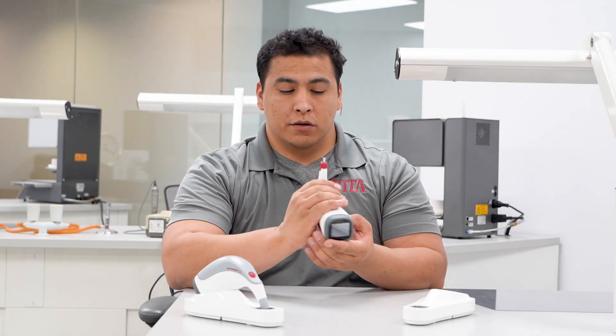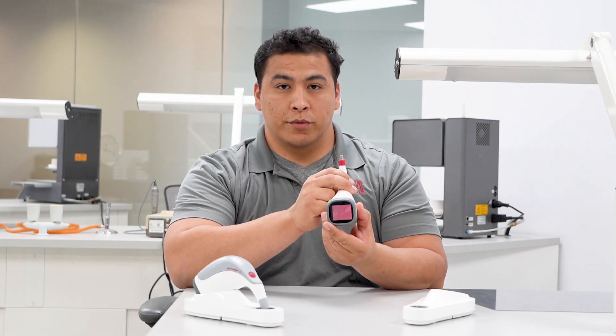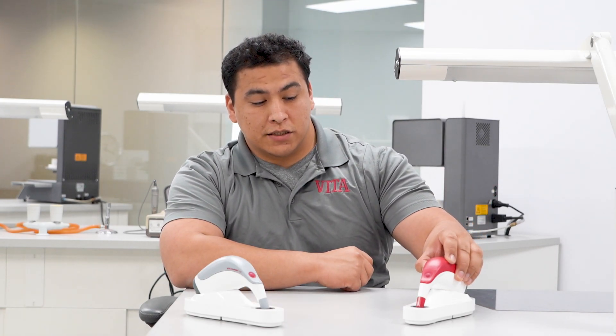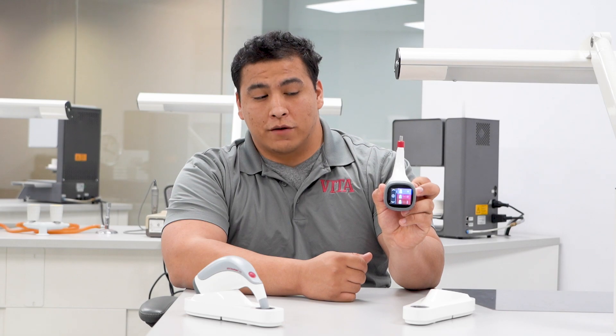Give it a small push and it'll seat firmly all the way around. To confirm that it's powering on, push the red button on the back. In just a moment, you'll see it power on. It's going to immediately ask you to calibrate by returning it to its base. Press it on there, you'll hear a beep, and you'll be calibrated and ready for use.